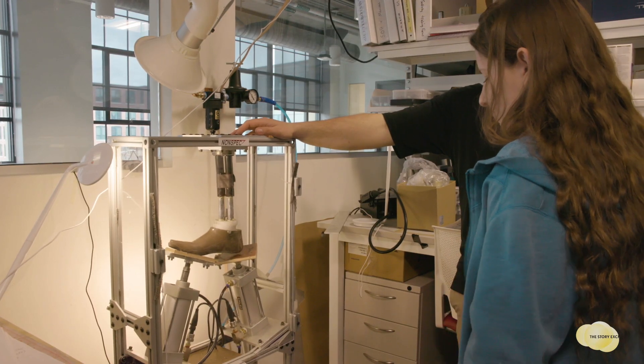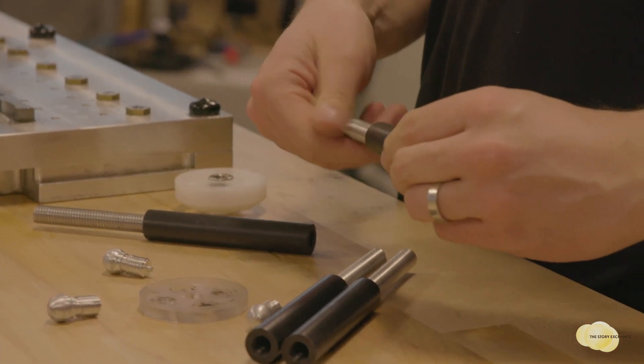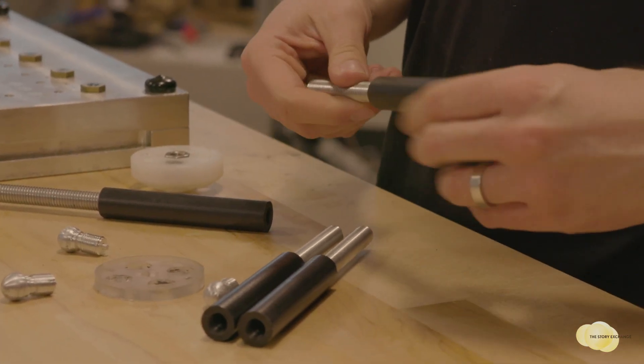Nonspec makes affordable, adjustable prosthetic limbs. It's actually an off-the-shelf kit that can be rapidly adjusted to fit a range of amputees and adjust with them as they change.